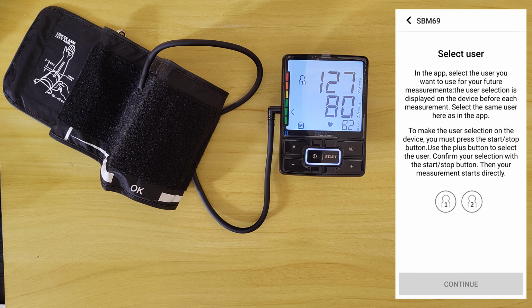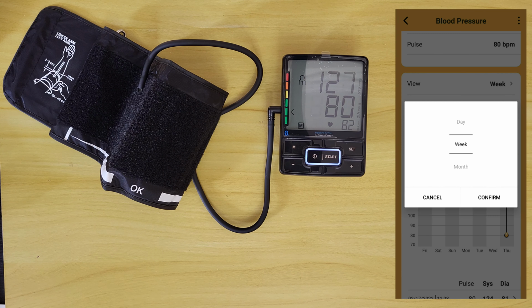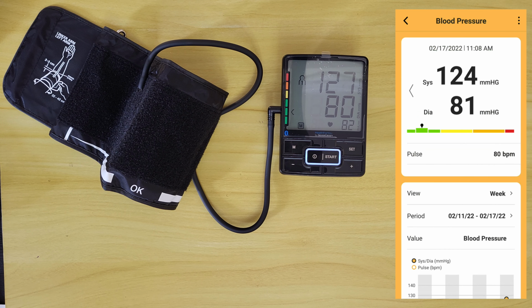Select user, the first, continue, and instantly there we've got all the values that I made on my smartphone. You can see the first value, the second value, pulse. You can view all that by day, week, month, year. You can see the diagram, pulse, systolic, diastolic, it says down here. I select it.